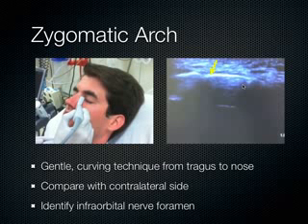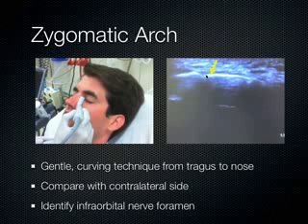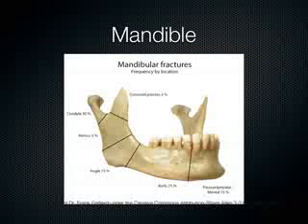And if you're looking for fractures, obviously, as we're doing this, when a patient comes in after blunt trauma to the face, and if there's any discontinuity or depression along that hyperechoic cortex of the zygoma, then you're suspicious for a fracture, although it's easy to identify that little step off over here. But that's just, again, that infraorbital foramen. You can always look on the other side if you have any doubts.